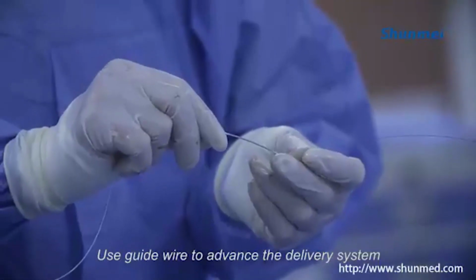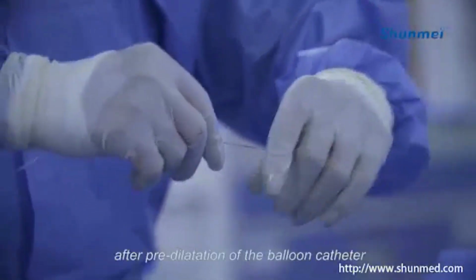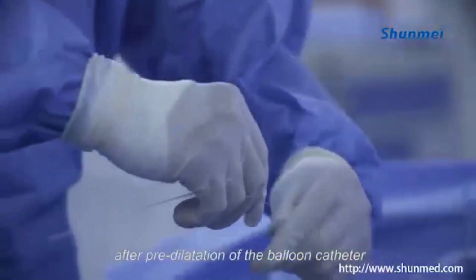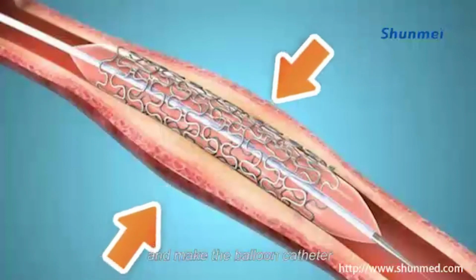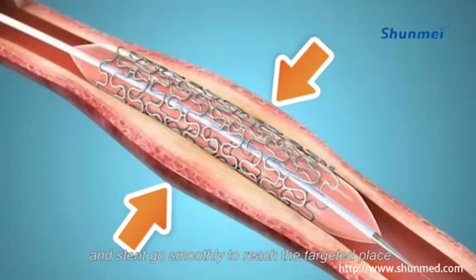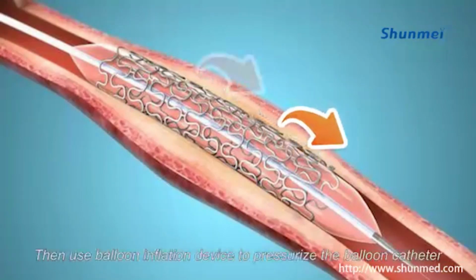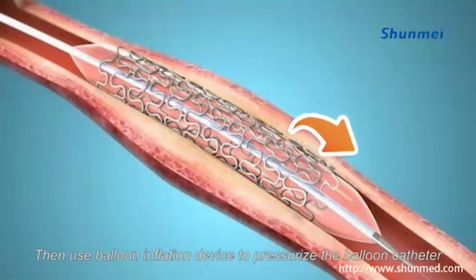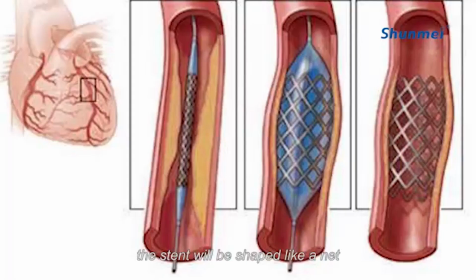6. Implantation of stent. Use the guide wire to advance the delivery system, balloon catheter, and stent. After pre-dilatation of the balloon catheter, intravascular plaques are extruded close to the inner wall of the vessel and make the balloon catheter and stent go smoothly to reach the targeted place. Then use the balloon inflation device to pressurize the balloon catheter and dilate the stent. After dilatation of the balloon, the stent will be shaped like a net.